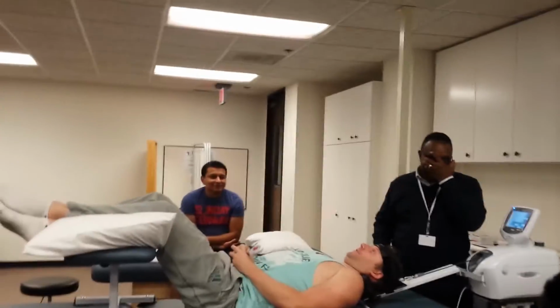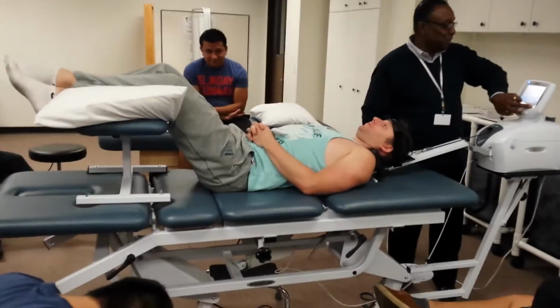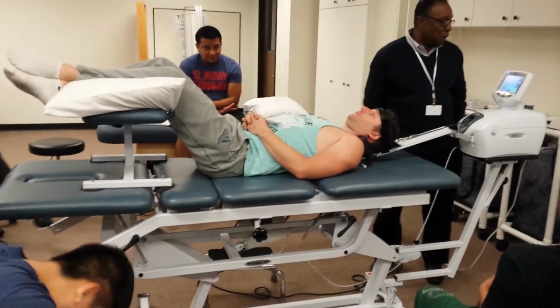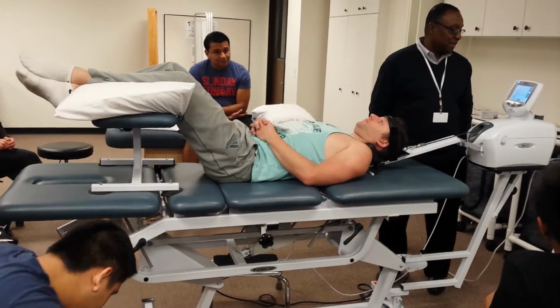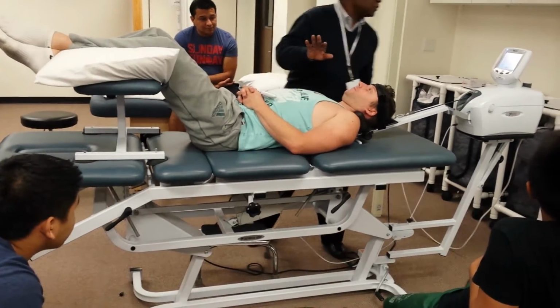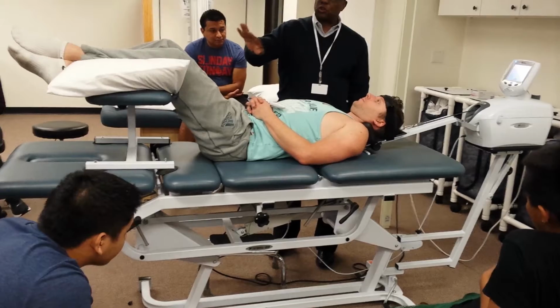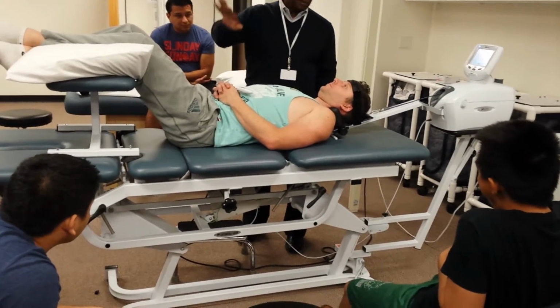So I'm going to start. Oh, wait a minute. Here we go. We're going to start. So this is going to start off slow. Again, just like the other one did, but now we're on intermittent, so it's going to release a little bit more. It's not going to be sequential like the other one. The other one just built on it. It was progressive. This one's going to actually release you and then come back.